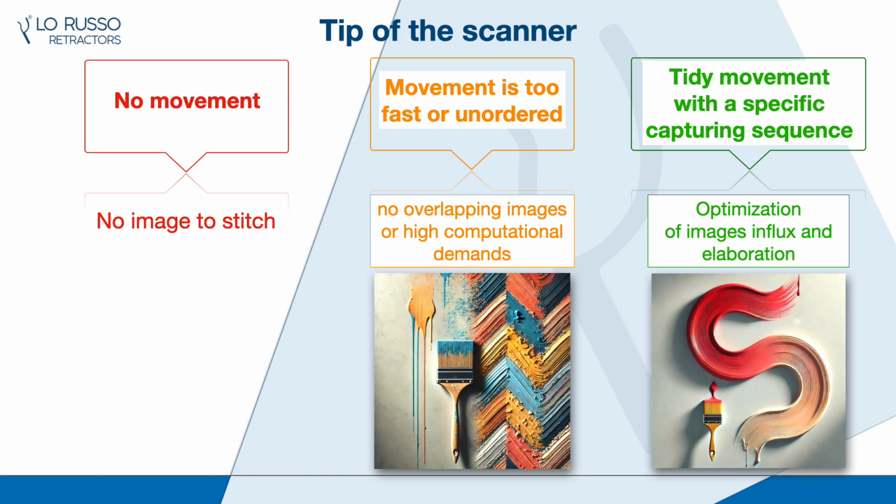Therefore, the goal of our protocol is optimization. A tidy, rhythmic movement sequence synchronizes the image influx with the software's stitching capacity. This creates a fluent, seamless transition from 2D data to a high-fidelity 3D model, ensuring that the final digitization is both reliable and clinically predictable.